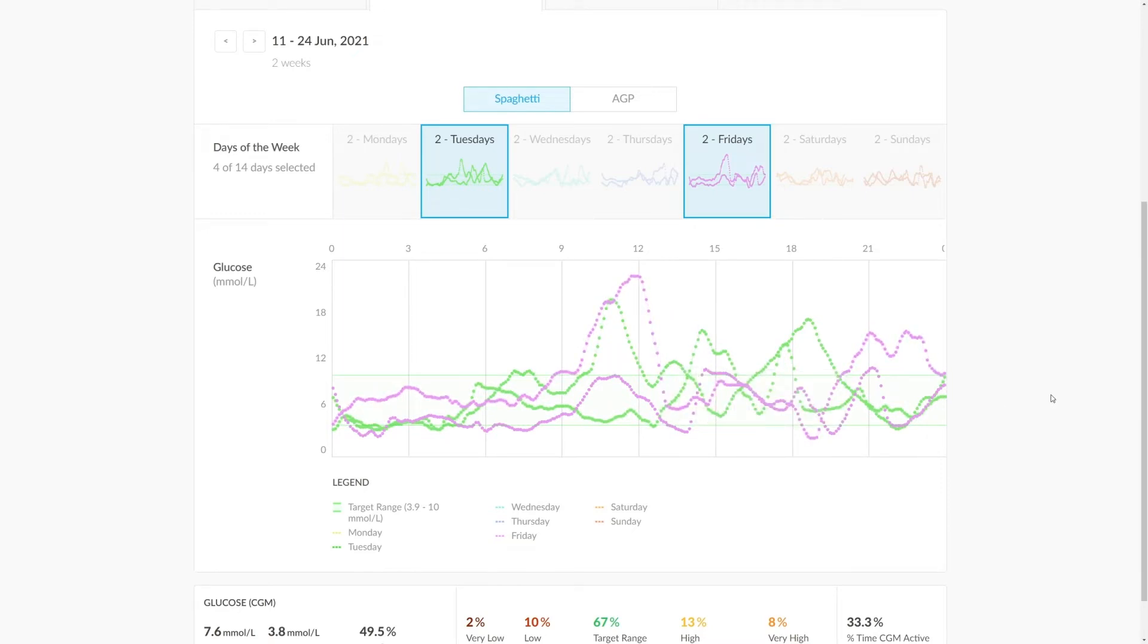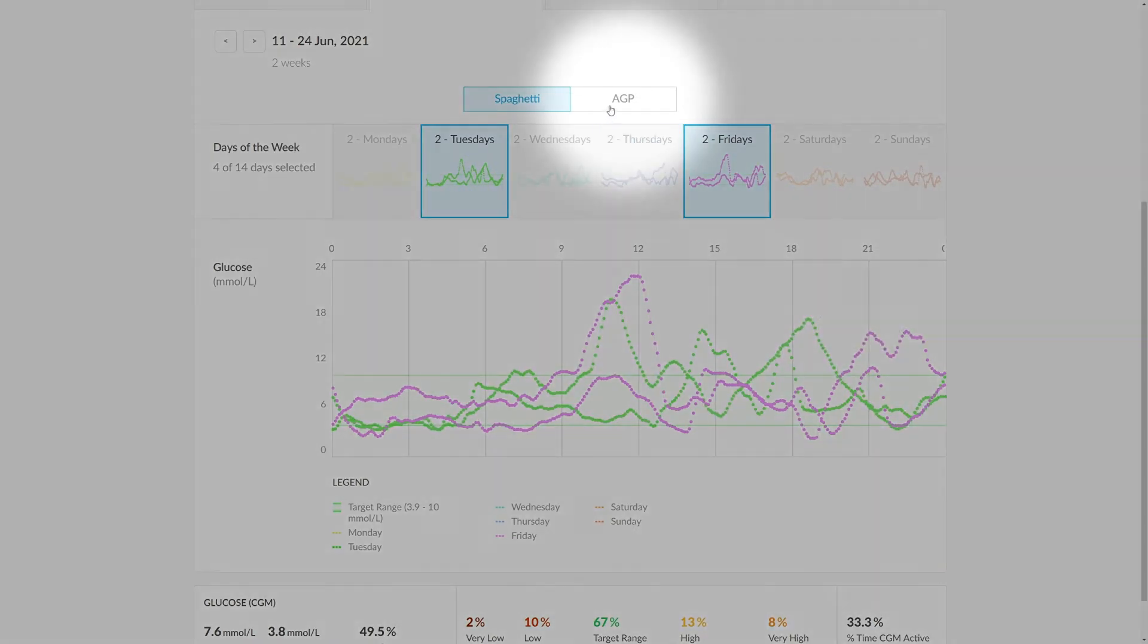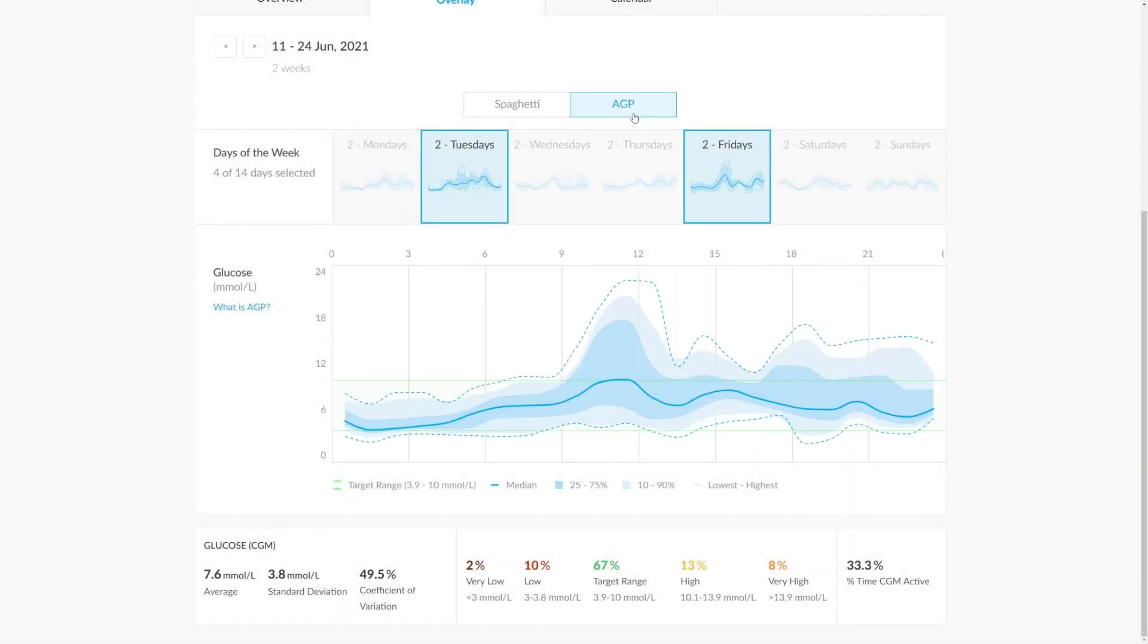Alternatively, you could click onto the AGP section. After doing this, you can see that the AGP is adjusted specifically to cover these two days, and you can see how the variation of results around the median looks both before and after the peak.